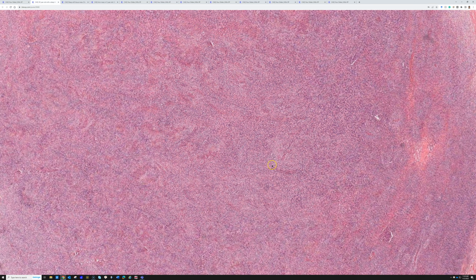And I think the other thing to know is that when they have the areas of infiltrative cord-like growth with sclerotic collagen, that's great. But sometimes you get solid round cell areas or almost sheet-like epithelioid cells where there's not as much background collagen.